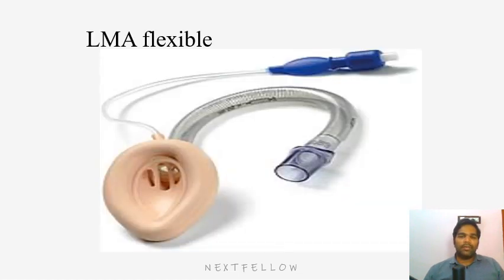Now this is LMA Flexible. LMA Flexible is almost the same as LMA Classic, but the only difference is the tubing, the shaft of the LMA Flexible, is armored. Armored means it is lined on the inside by metal rings. So it cannot be compressed, it can be easily bent, and it can be changed to any shape.